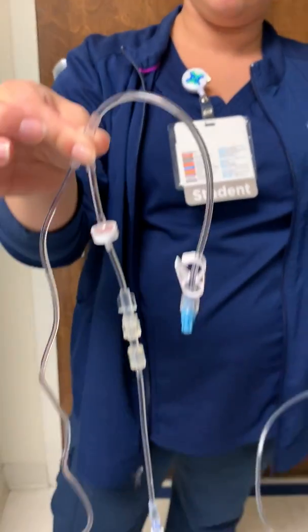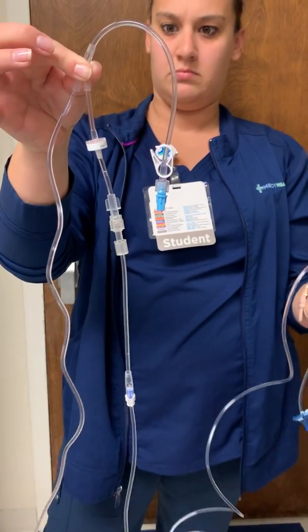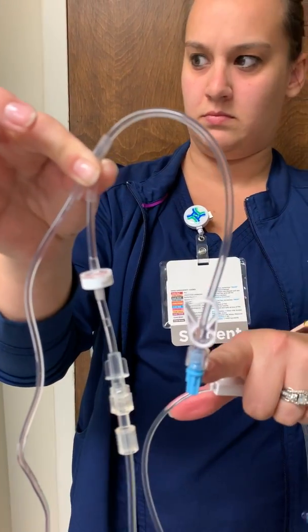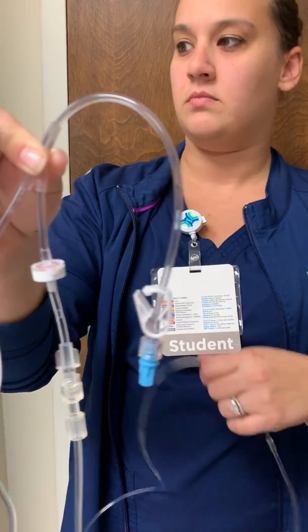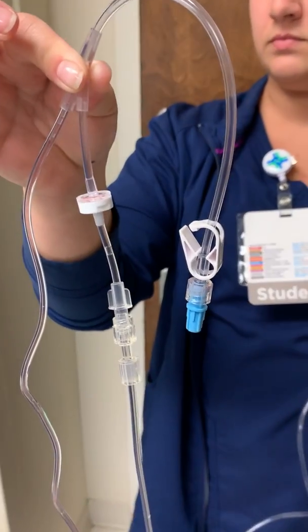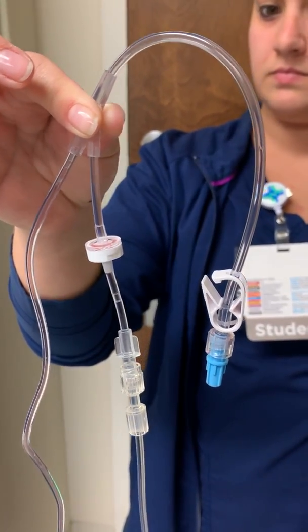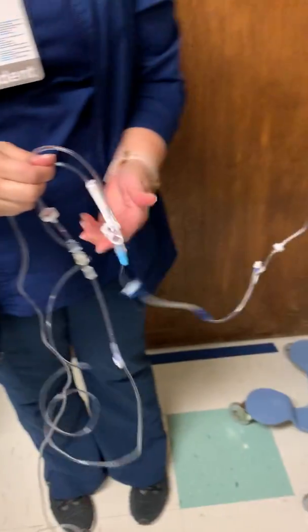So when priming is complete, the primary infusion fluid should occupy the tubing between the Y site and the patient. So that's primary fluid in there, because if you don't do that, the patient will get a bolus of medicine when you begin. So now we're going to talk about loading the syringe.